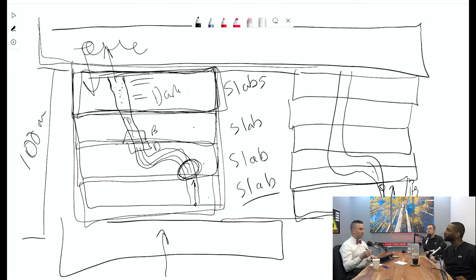If the patient is a young kid or doesn't have any kind of issues, you probably don't need that tone ramp. You don't need to change because the blood is flowing so fast that it doesn't have time to become saturated. So that's the idea of a 3D.